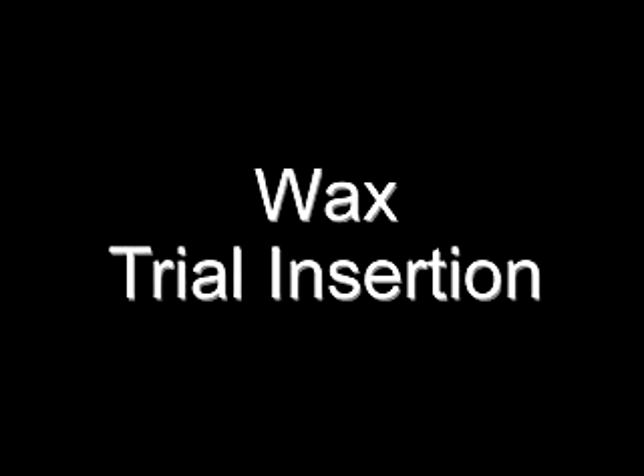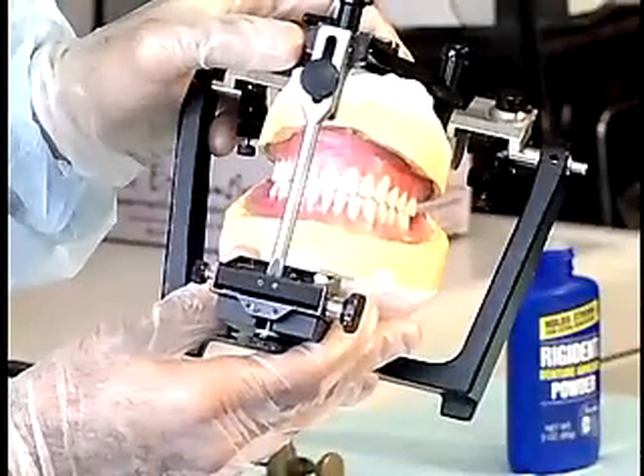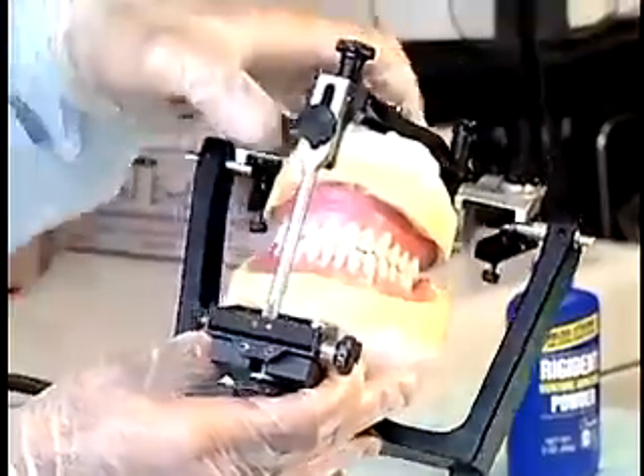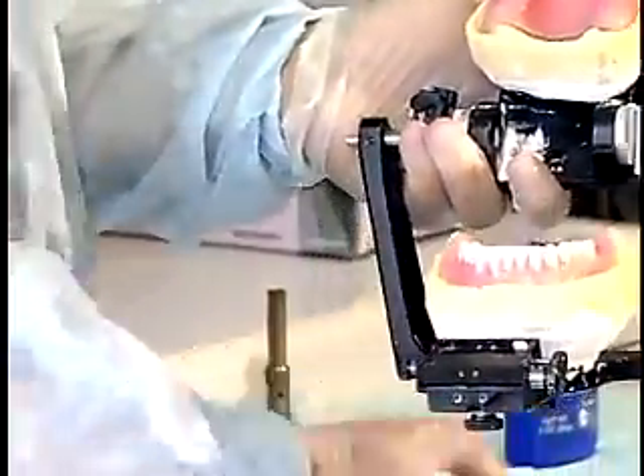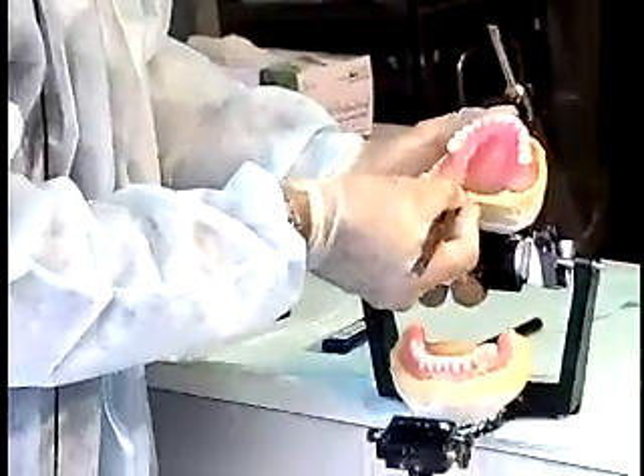Check the size, form, shade, and arrangements of the teeth on the articulator. Harmony and pleasing natural appearance are the goals.